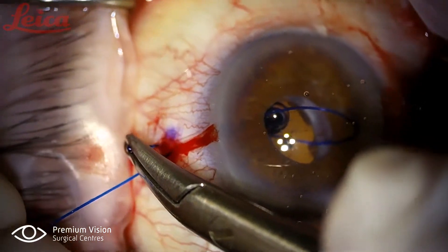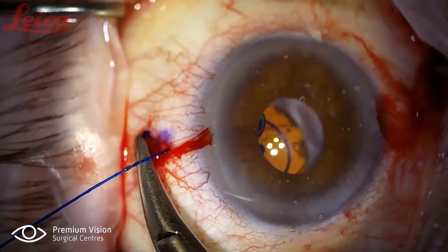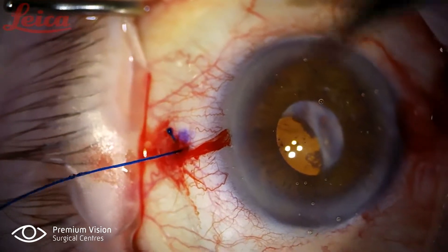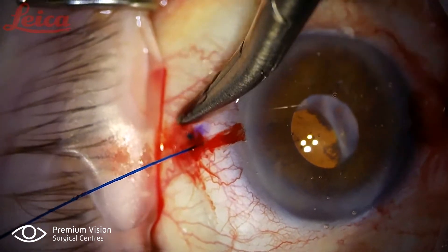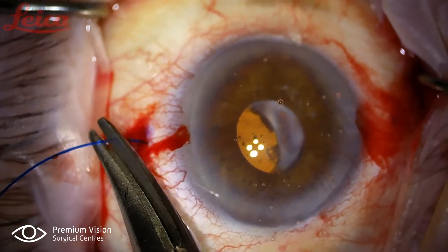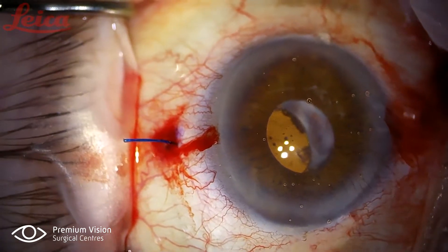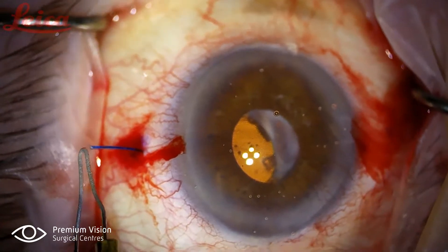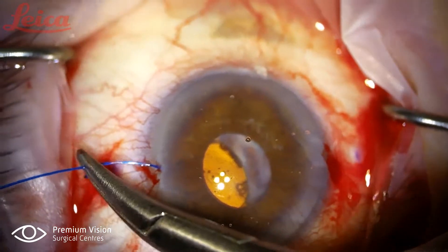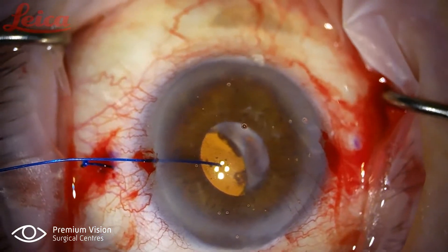I'm pushing one side and pulling the other to gently center the lens in place. It's very important for these two sutures to be passed radially from the cornea so both are one in front of the other — if there's any displacement between them it will produce a tilt of the capsule tension ring and the intraocular lens. I'm cutting it now but planning to shorten it later; I've left some leeway in case I need to pull the lens forward a little further when doing the other side.